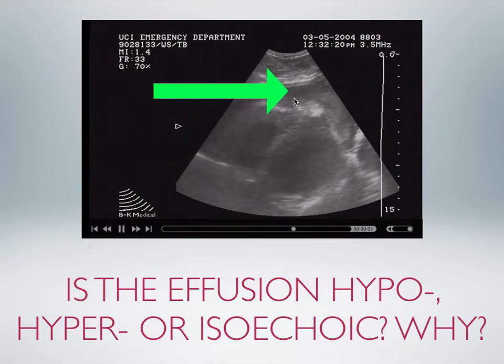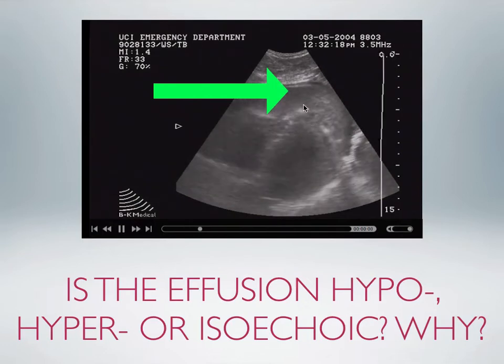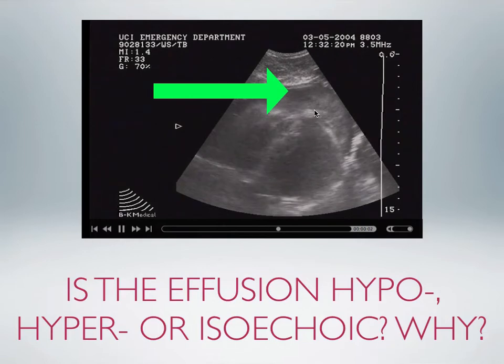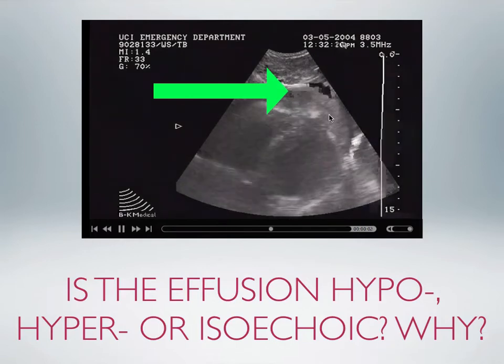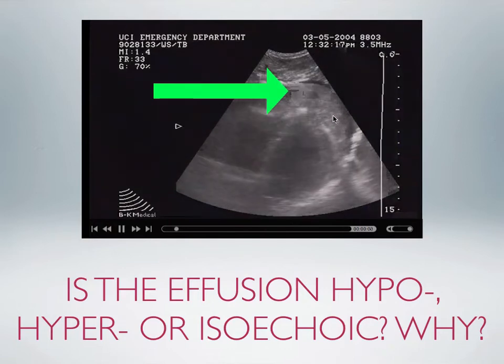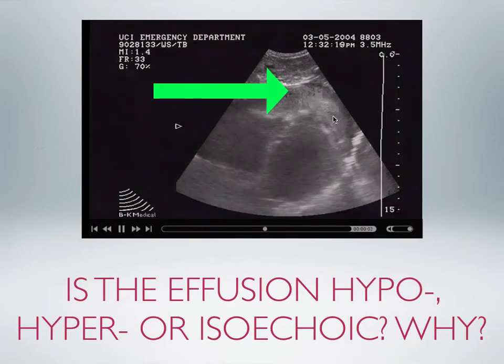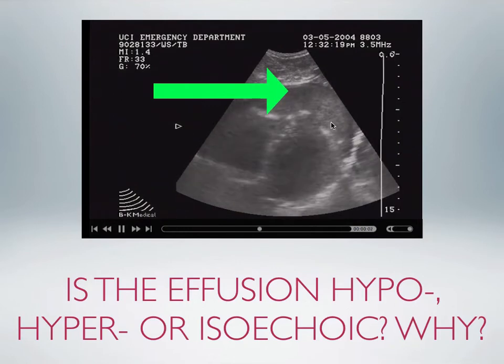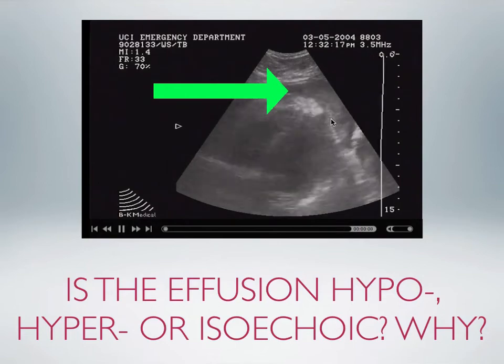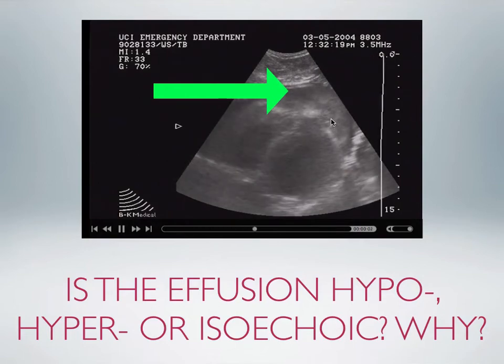This is a person who had an injury to their chest, and this is blood inside the pericardial space. Now, how do we know this isn't a fat pad? Well, number one, it's rather large for a fat pad. But number two, a fat pad is on the heart and moves with the heart. And you'll see over here, this blood, which is partially coagulated over here, is sliding independently of the heart. So this has to be a foreign body, which is typically blood inside this pericardial space.